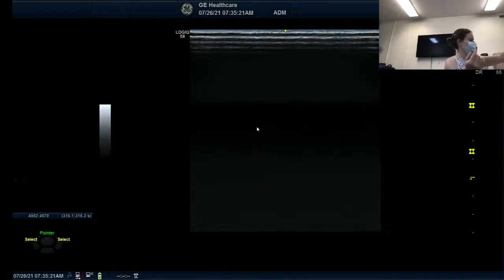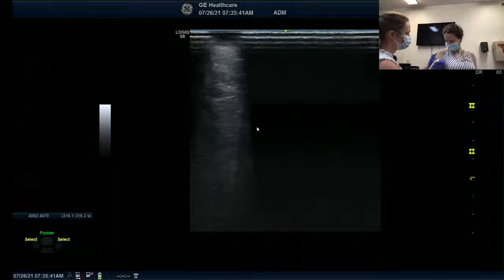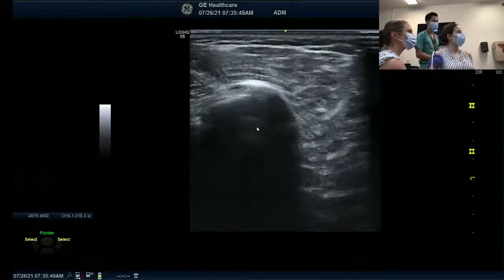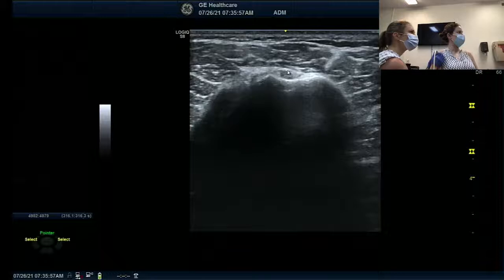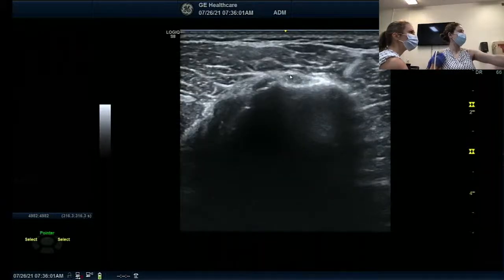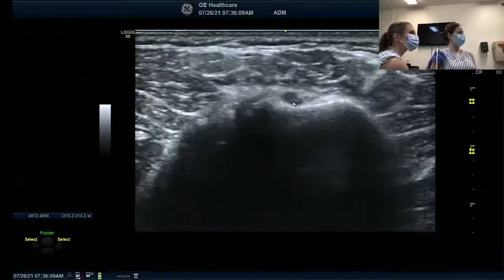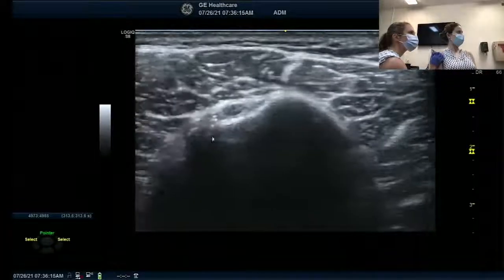I've had zero ultrasound experience, but my anatomy is very good. So this is our guy that should always go medial. I see the biceps tendon — follow it up on the right a little bit. Medial to that is our subscapularis, and lateral is supraspinatus.